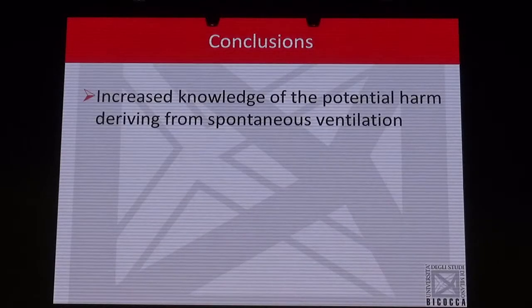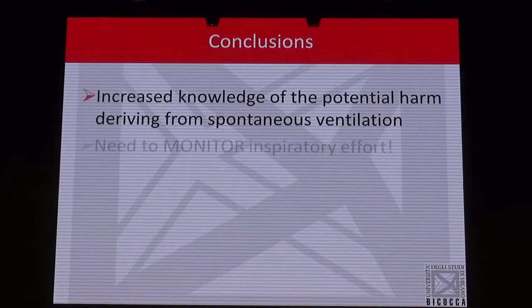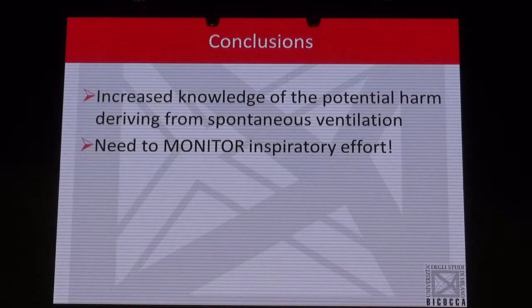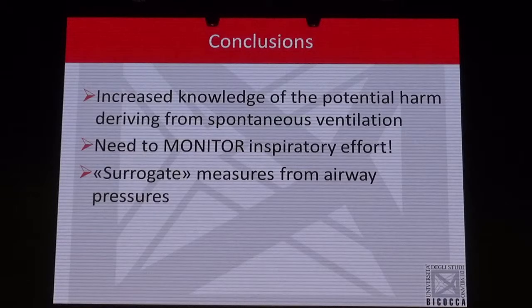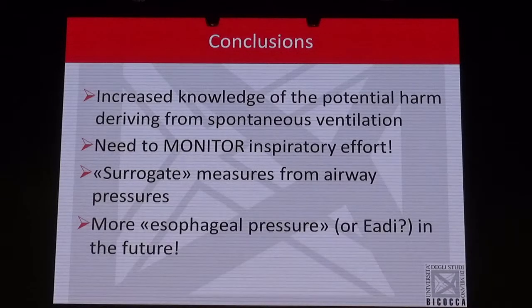So in conclusion, I think there is an increased knowledge of the potential harm that spontaneous breathing can do to our patient. I think we need to monitor inspiratory effort, whether it be P0.1, esophageal pressure, EDI, name it, or thickening fraction of the diaphragm. But we need to know what the patient is doing. There are some surrogate measures from the airway pressure, as I said, and perhaps more esophageal pressure or EDI in the future.